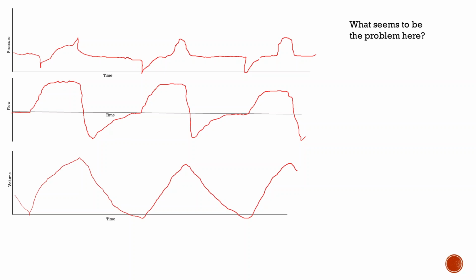Okay, so this is a real tracing. It's really hard to know exactly what's going on because you want to figure out what mode of ventilation it is, but it's difficult. So I will give you that: this is any of the automated modes of ventilation that we have. This is not what we're used to seeing on PRVC, right? Because that's the one we use here.